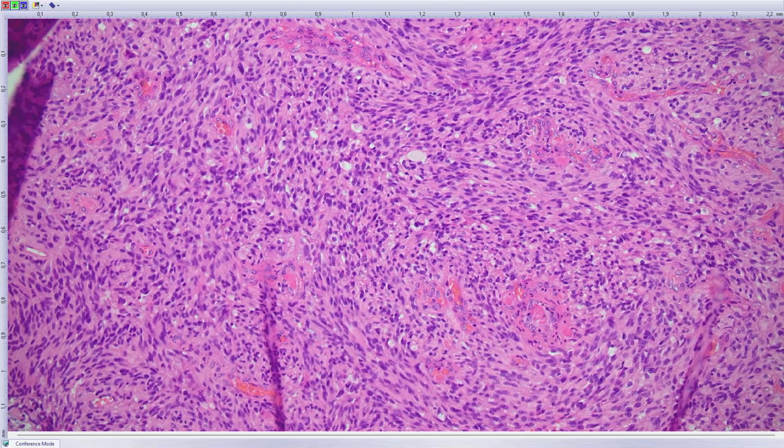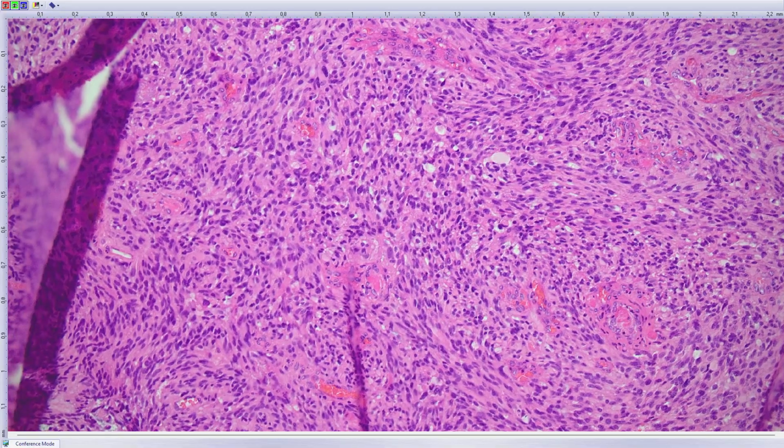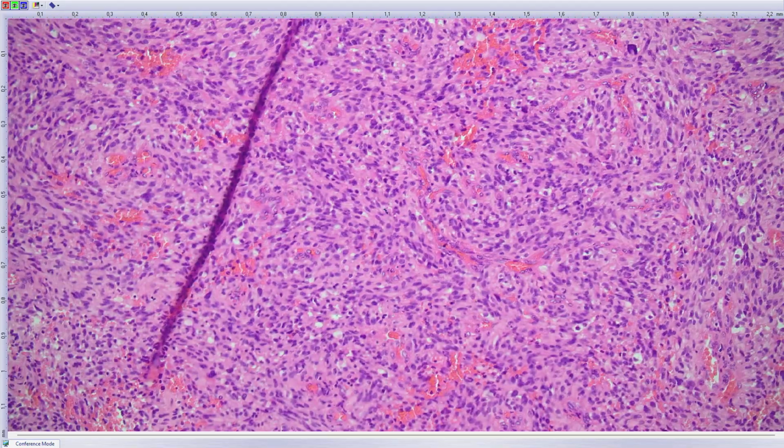misdiagnosed. In fact, this is one of the most frequent misdiagnoses in neuropathology: pleomorphic xanthoastrocytoma diagnosed as something else, most typically as high-grade glioma, glioblastoma. If you have a patient with a glioblastoma or some other high-grade type of tumor surviving for 10, 15, 20 years, you should do methylation profiling, and in many cases you will find out that it's pleomorphic xanthoastrocytoma.